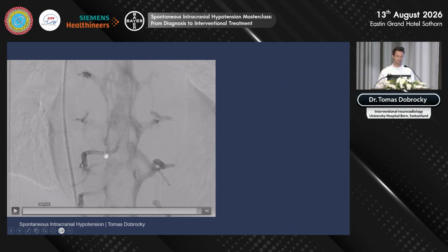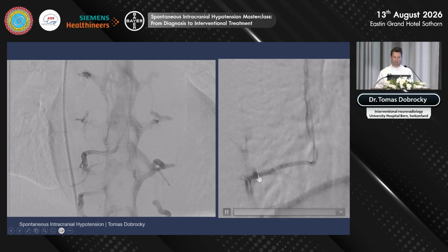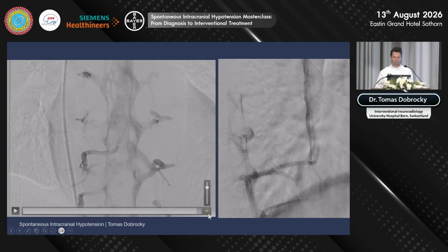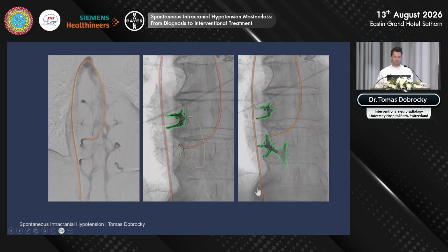of the venous anatomy. So these are the segmental veins. Then you can see the longitudinal system, which is the epidural plexus, and you can see connections between behind the dura or the epidural plexus, which is more of a small and delicate structures in the midline. Again, the same one in the lateral. You can see segmental vein, then going into the foraminal veins, and this is the epidural venous plexus. So it's quite a nice anatomy.